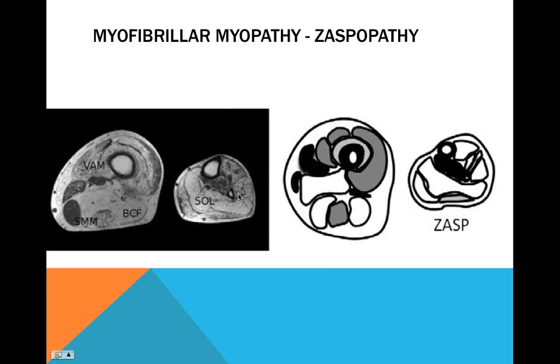Right. So I have another question. I don't want to interrupt. Not at all. Many of these diseases or conditions are progressive, no? Right. Yep. Do we get the same picture of spared muscles and muscle that's wasting, or could you see a correlation between onset of the disease and the time where you did the MRI?